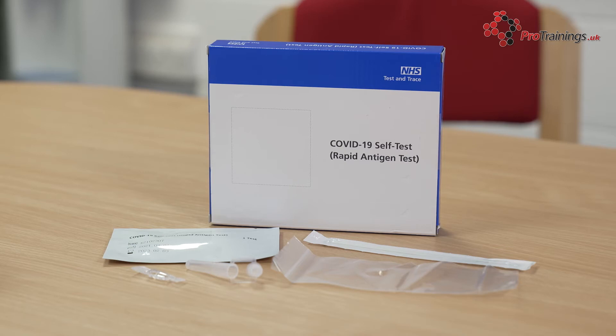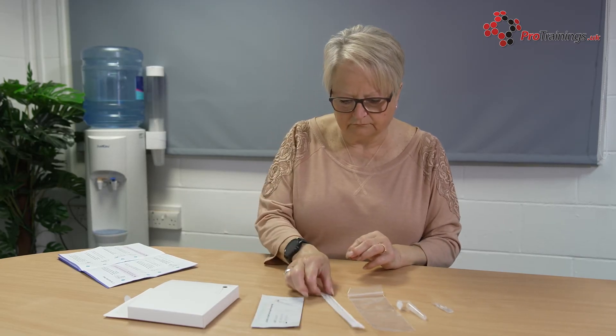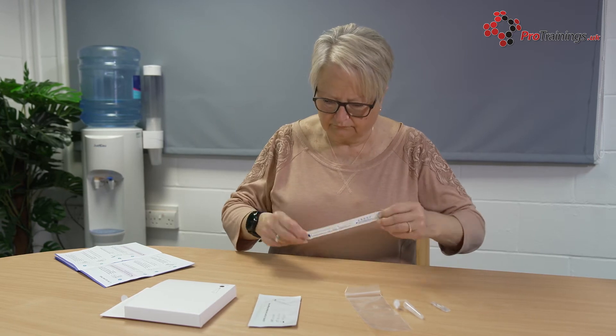The kit we are using is the UK NHS kit, which is available free in some regions. Check all the items to make sure the packaging is not damaged. If it is damaged, do not use it.